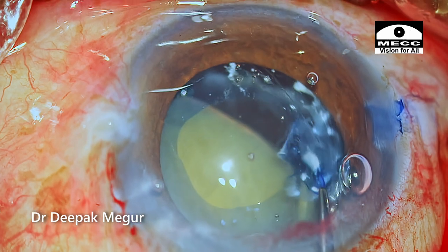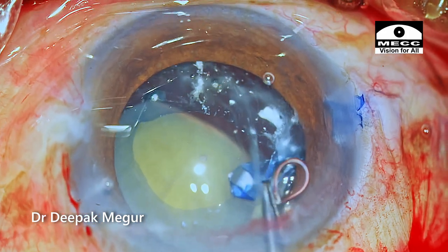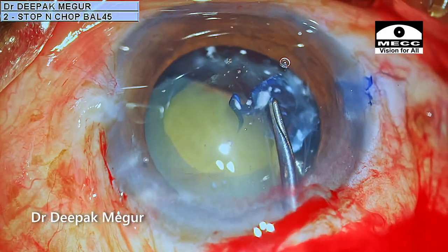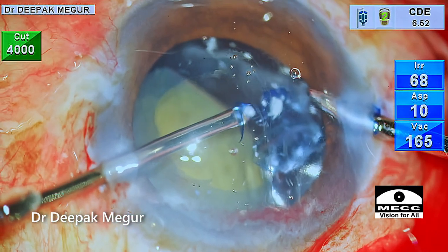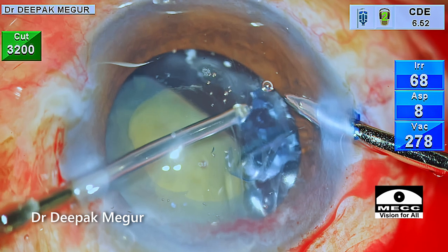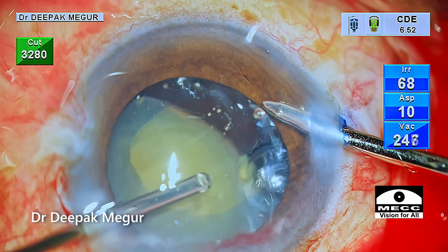Unfortunately I hit a roadblock — as I try to tear the capsule, the bag in that quadrant is threatening to come out. So I stop and use a different technique: I use a vitrector to cut the area of the capsule which has extremely loose zonules. The benefit of using a vitrector is that it cuts the capsule without causing any traction. We can also use scissors, but this is my preferred technique.